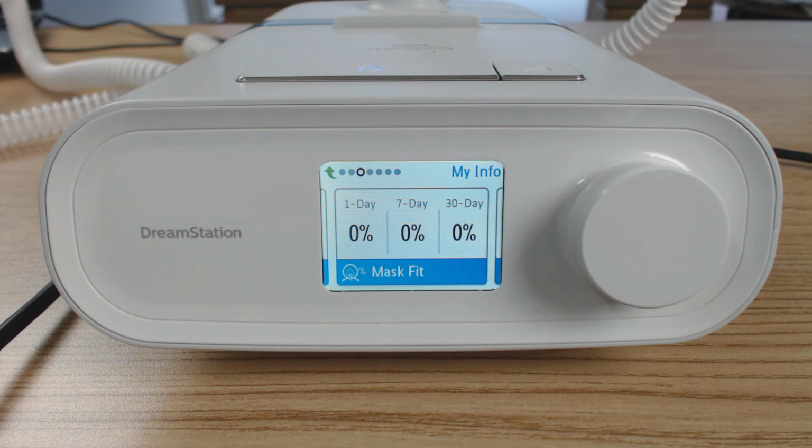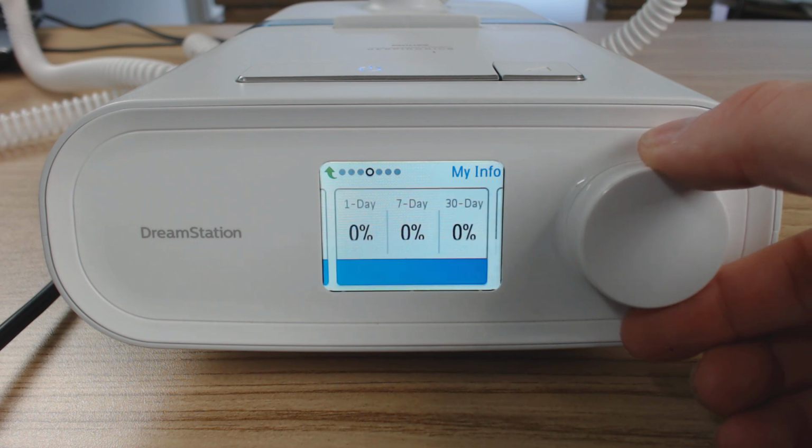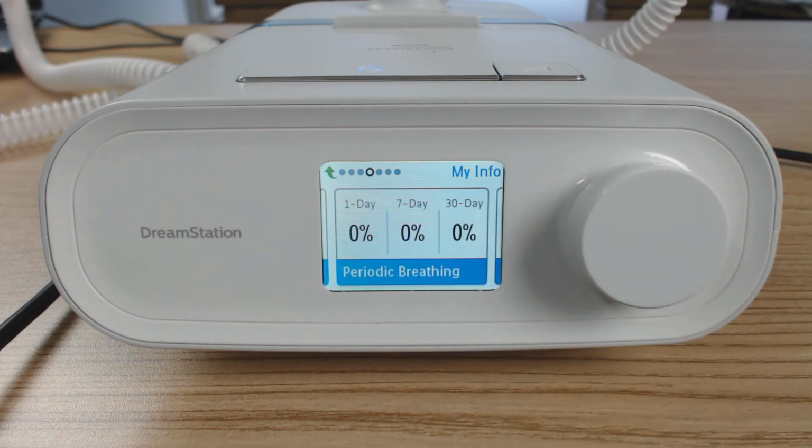All right, and once again, it displays the 1 day, 7 day, and 30 day averages. If we scroll on to the right there, periodic breathing. This displays the percentage of time that the user experienced periodic breathing, and it displays the values for 1, 7, and 30 days. If you observe a large increase in the percentage of time in periodic breathing indicated here, contact your home care professional.